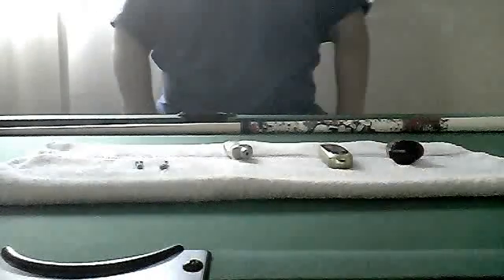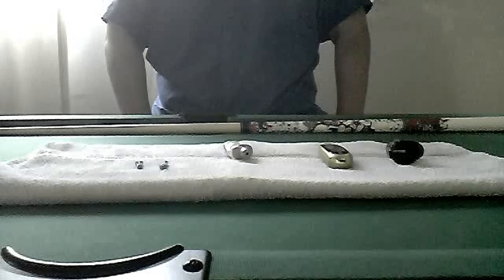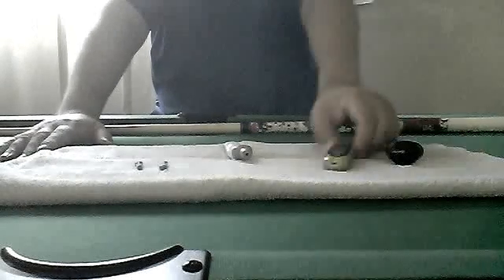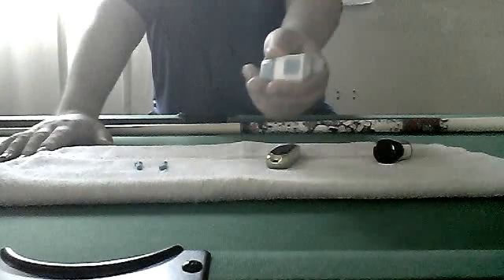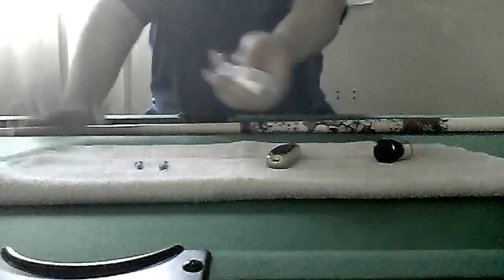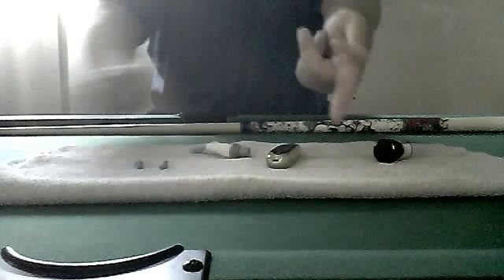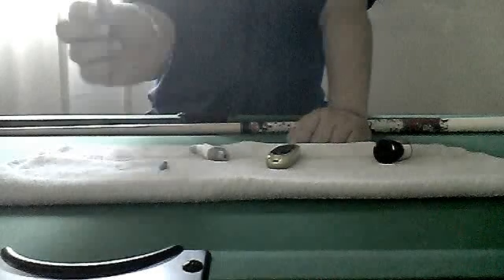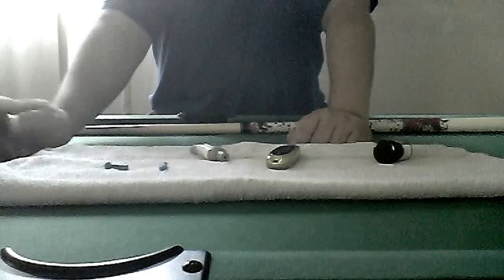I'm going to show you how to test your blood sugar levels with just about any machine out there. First of all, you have the machine itself, then you have the poker — this is what pokes you. You put your finger here like that and you push the button, and it gives you a little poke with the needle. You need needles — they're right here.